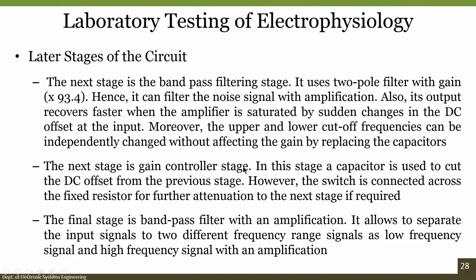So, you have seen how the dry electrode looks and which company makes it. We need to import the dry electrodes for understanding the EEG signals. In the experiment part, we will show you how the dry electrode looks. Let me play the second video, which shows how the EEG signals are captured.